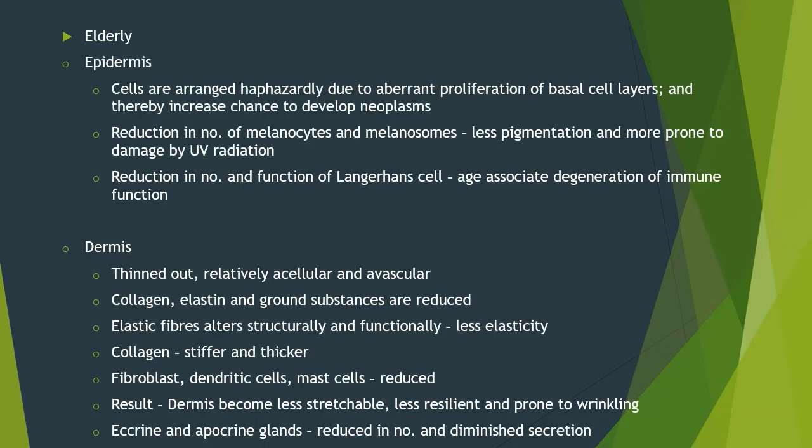The dermis becomes thinned out, with a relatively acellular and avascular stroma. The collagen, elastin fibers, and ground substance are also reduced.